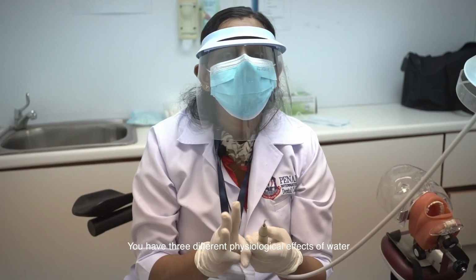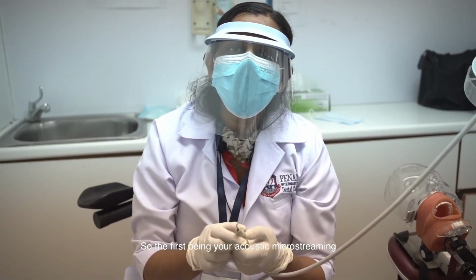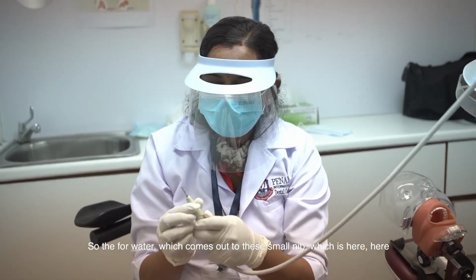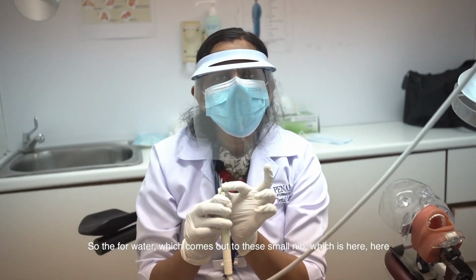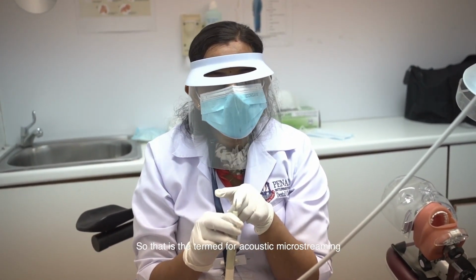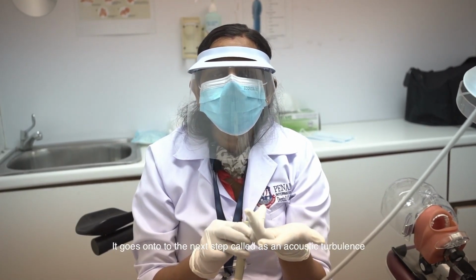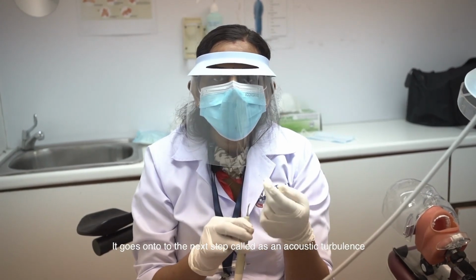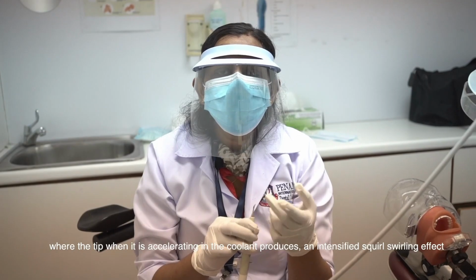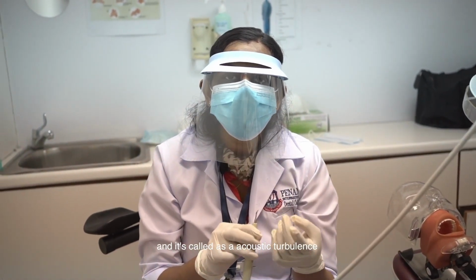You have 3 different physiological effects of water. The first is acoustic microstreaming, where there is a unidirectional flow of water. The water which comes out through the small nib here comes out in a unidirectional flow. That is termed acoustic microstreaming. After acoustic microstreaming, it goes on to the next step called acoustic turbulence, where the tip, when it is accelerating in the coolant, produces an intensified swirling effect, and it is called acoustic turbulence.